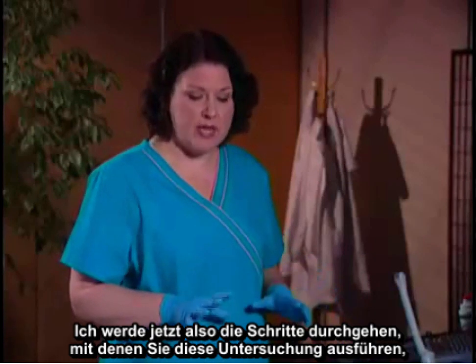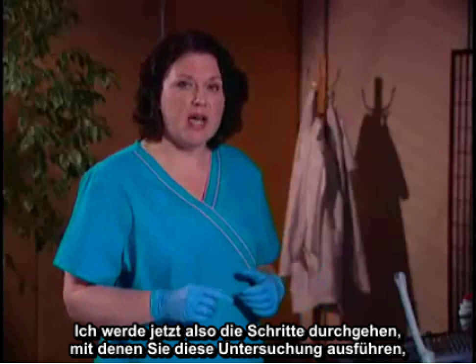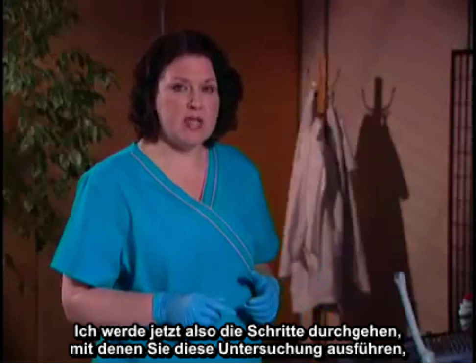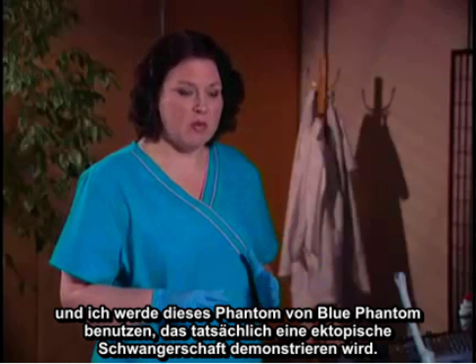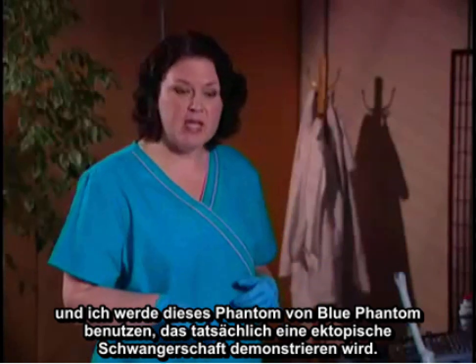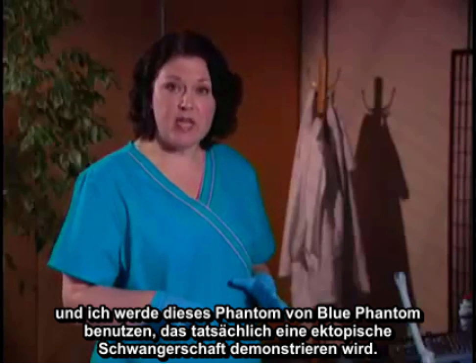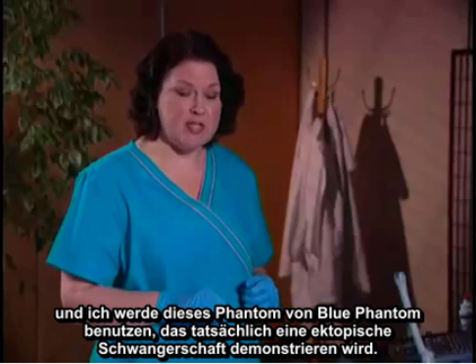What I'm going to do right now is walk through the steps on how you would do that examination, and we're going to use this phantom by Blue Phantom that will actually demonstrate an ectopic pregnancy.